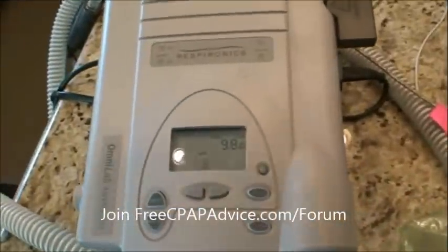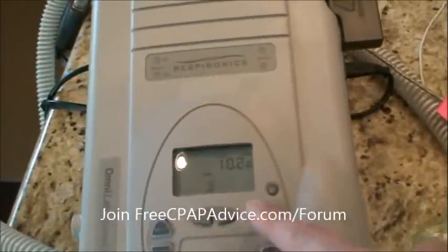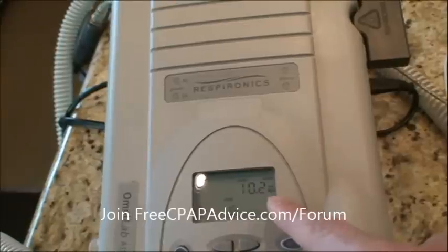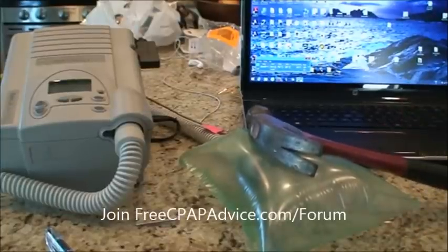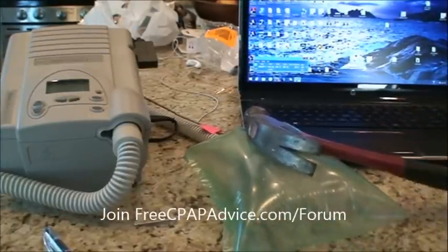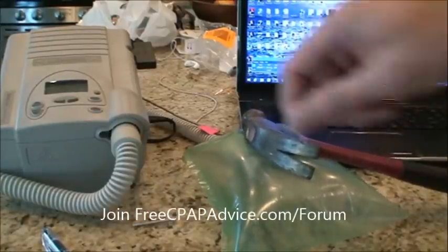You can see here that because of the oscillating of the bag, like a person breathing, it's always in this constant state of trying to keep it at 10. So it's bouncing around a little bit, which is totally normal, completely normal. Okay, right now our leak is perfect. So we have a leak at 23. So these holes here, this is an ideal situation. This person has CPAP on and they basically have no mouth leak.